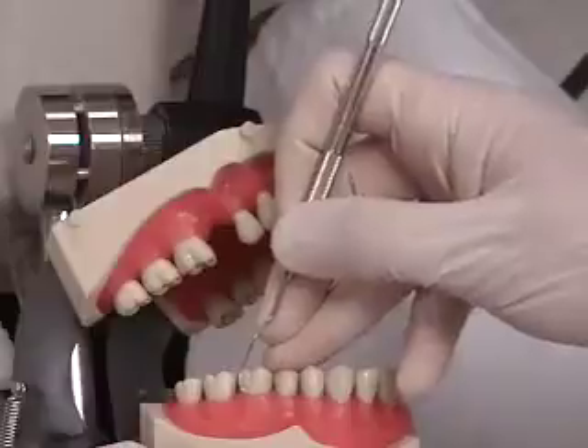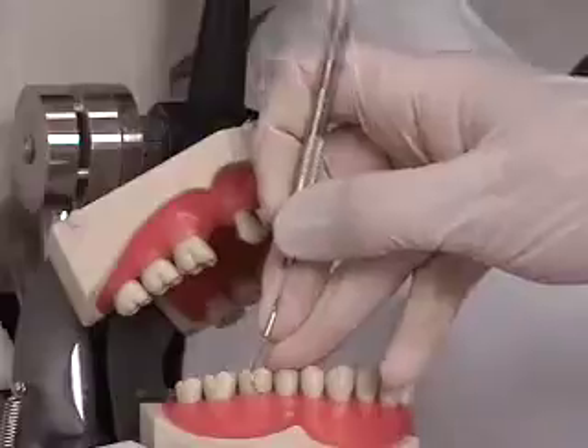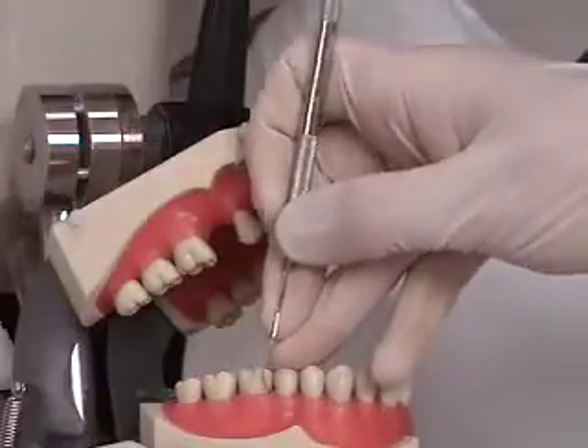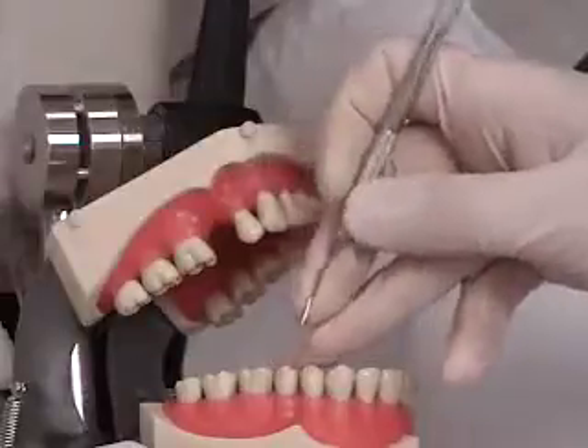We switch to the other side of the tip and come across the facial using a side-to-side wrist rock, switching to a front-to-back wrist rock when we get to the mesial line angle going into the interproximal.